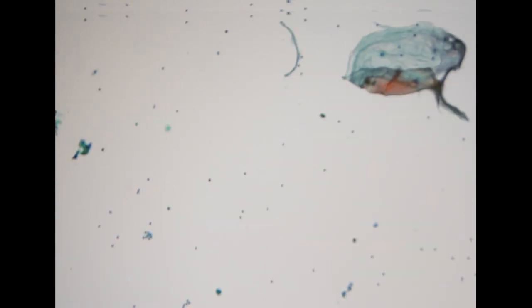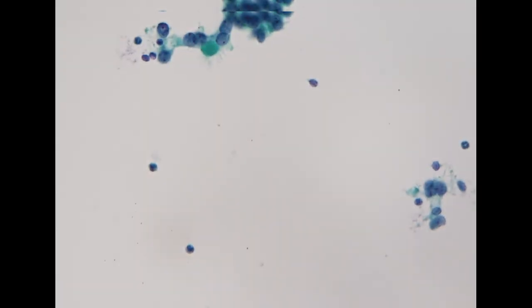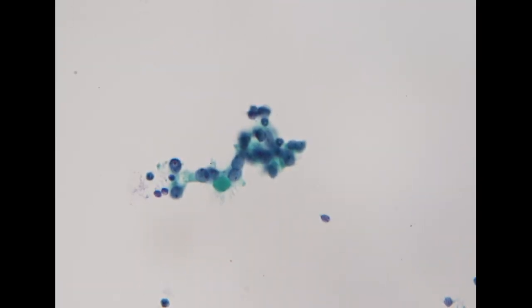The sonography feature is consistent with a follicular tumor. So I would still call this suspicious for follicular neoplasm. Basically, this is the same diagnosis as last time, and based on the diagnosis, the clinician should at least do a single lobectomy because the tumor is very big.